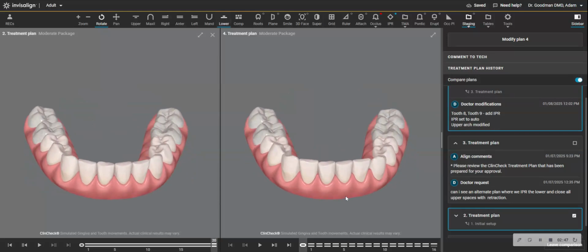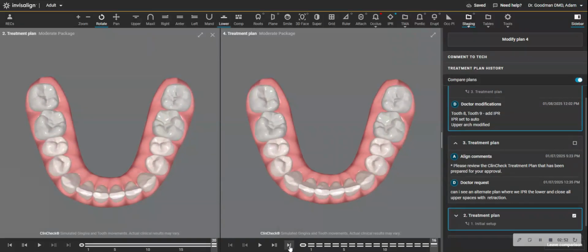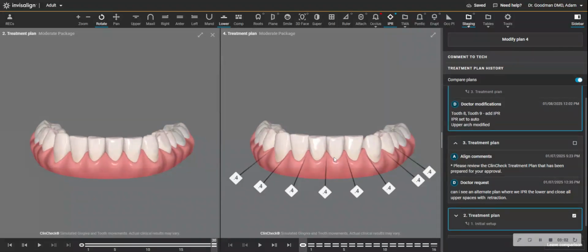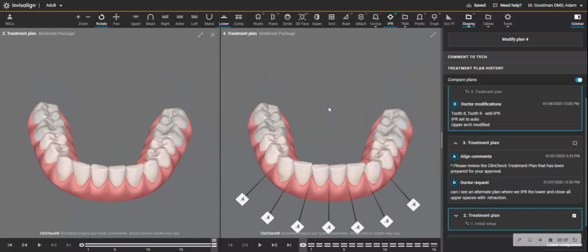So if you want to get the lower teeth straight, you do so by aligning them and moving them in. Well, how do you have the room for that? You have to do what's called interproximal reduction. And this is a lot of interproximal reduction in this case. And these teeth are not particularly wide. Interproximal reduction is safe and necessary for a lot of cases.